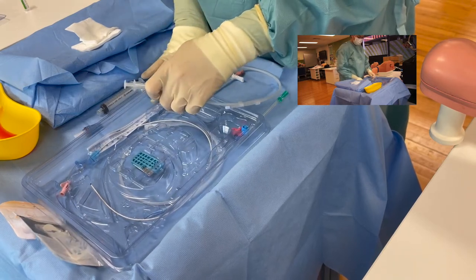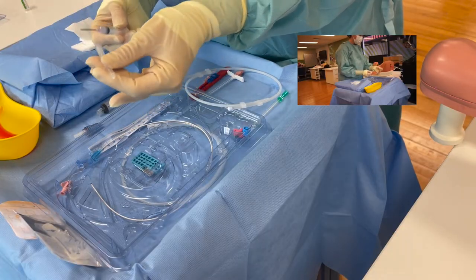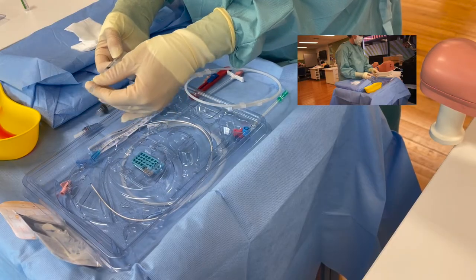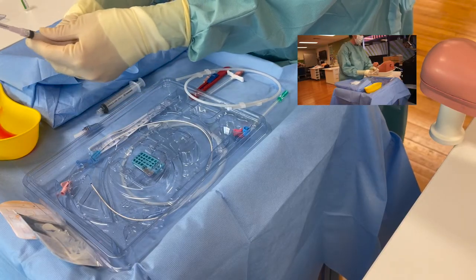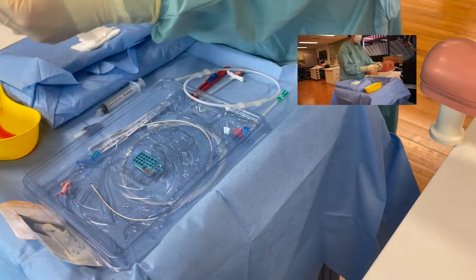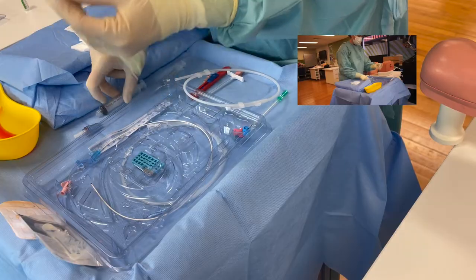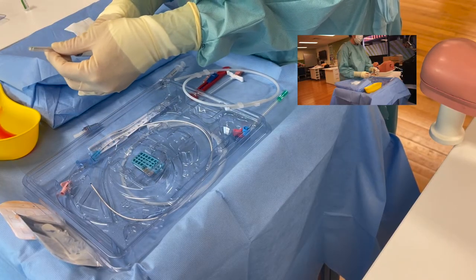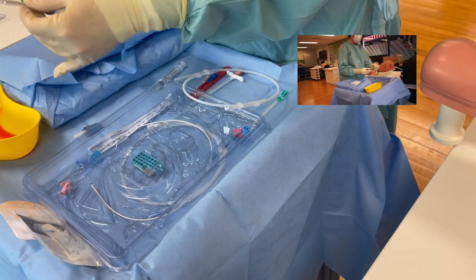With your blunt drawing up needle - it is perfectly safe to recap the blunt drawing up needle, but remember you still discard it like a sharp. You would double check your lignocaine 1% and the expiry date, then draw that up. Then you would attach your blunt drawing up needle to your 10ml syringe, double check your 0.9% sodium chloride plus the expiry date, and draw that up.